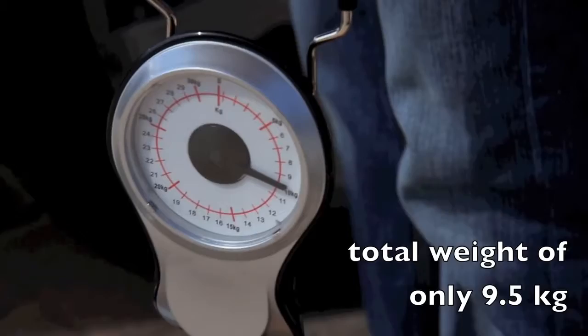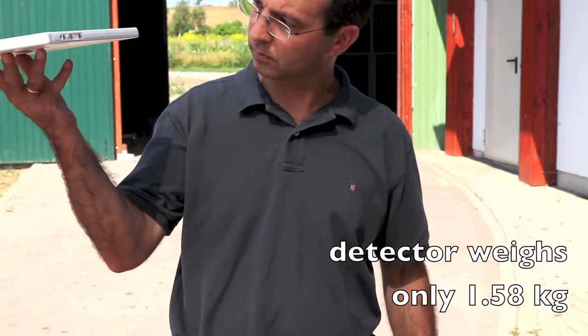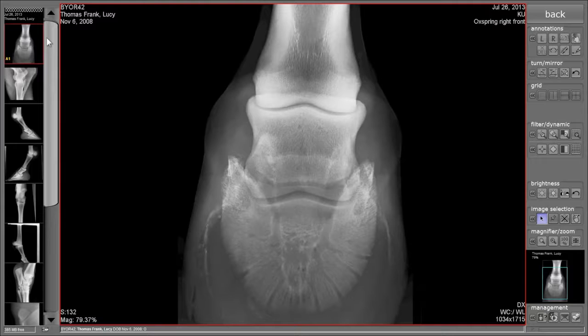The wireless DR detector integrated into the suitcase has an imaging area of approximately 24 by 30 centimeters, weighs only about 1.5 kilograms, and provides unbeatable image quality due to its high resolution.